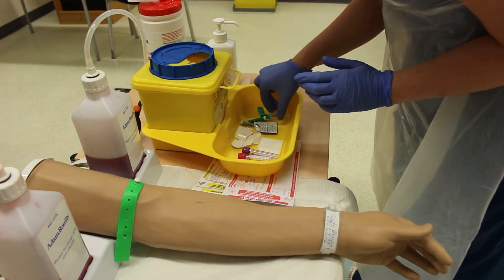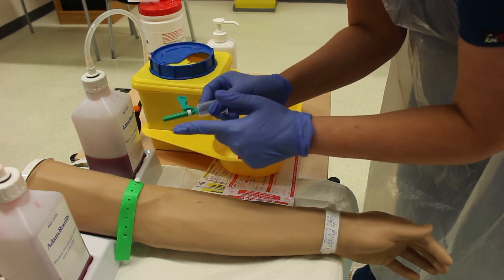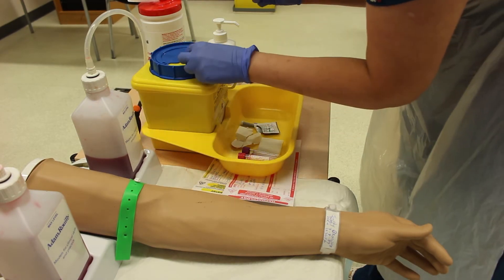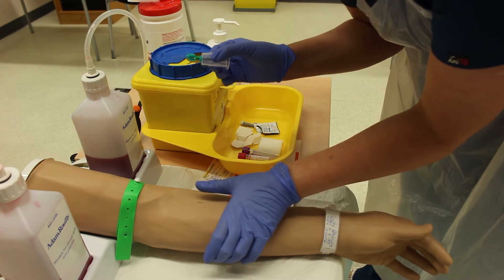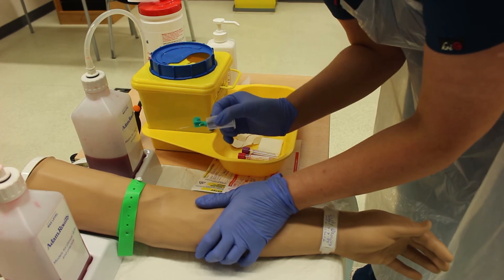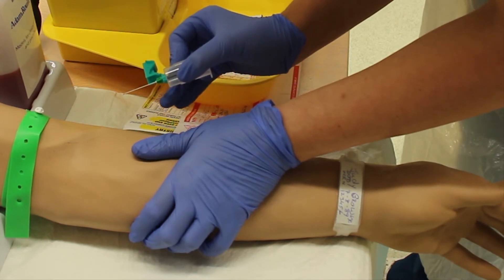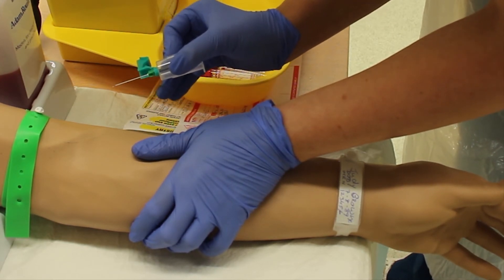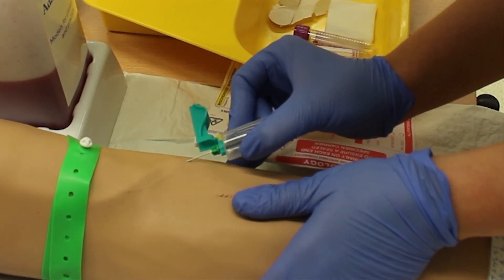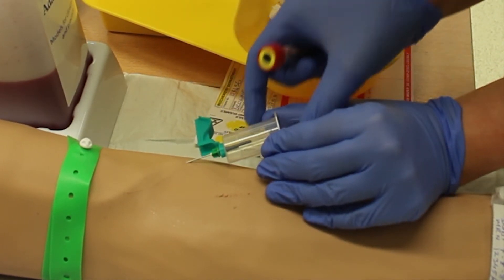I am not going to re-palpate the vein, as that would contaminate the field. I'll get my needle — kept clean with the cap on, so still sterile — remove the sheath and protect the key parts. With my non-dominant hand I'll stabilize the vein, kept lower than the angle of insertion. Needles should be inserted at a 10 to 30 degree angle with the bevel always upright.